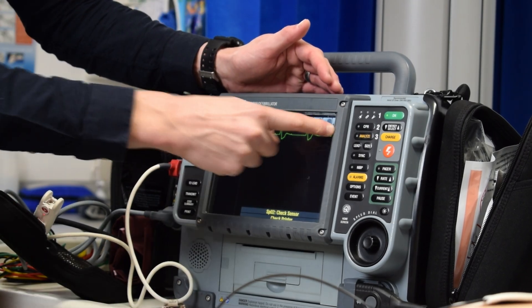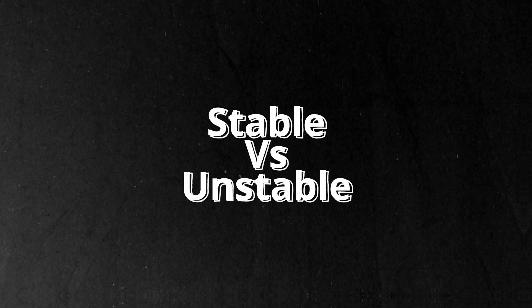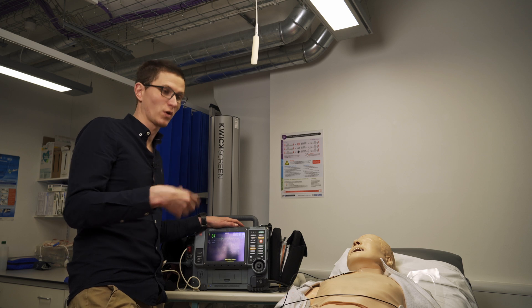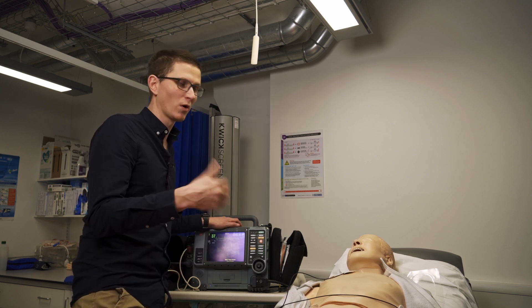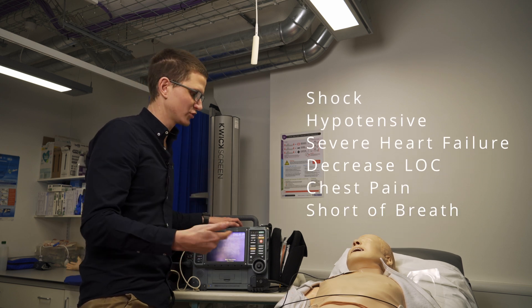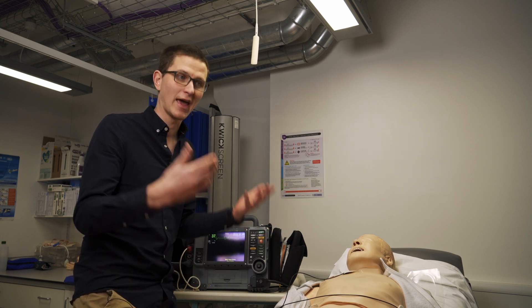Now we have a monitor on and we can see our rhythm. So how do we pace? First, who do we pace? The patient needs to be unstable. The AHA or UK Resuscitation Council guidelines will have different specifics, but in general it's people who are in shock — hypotensive, altered level of consciousness, chest pain, shortness of breath. All these things indicate they are unstable and in shock.